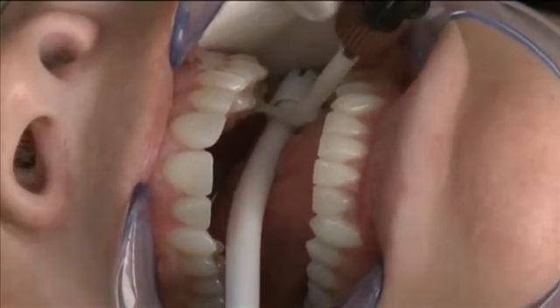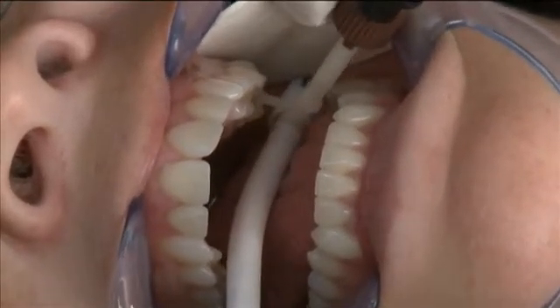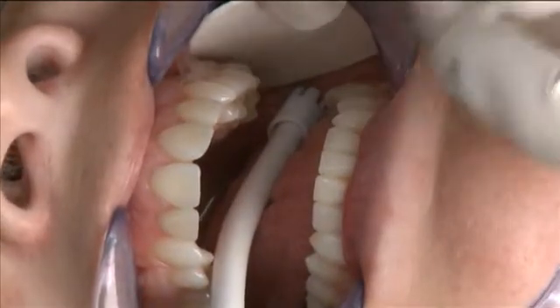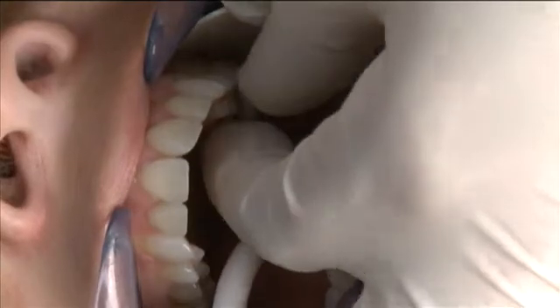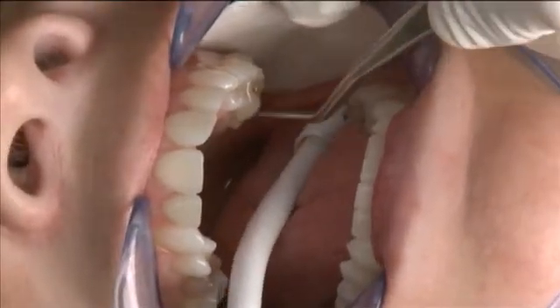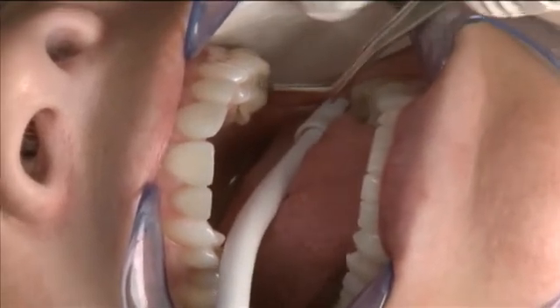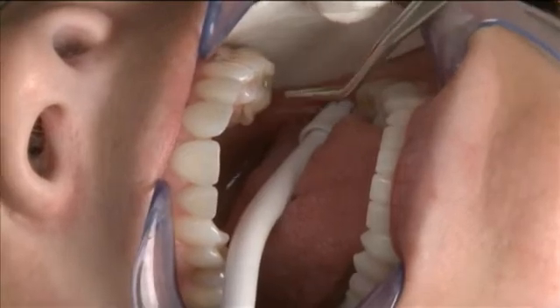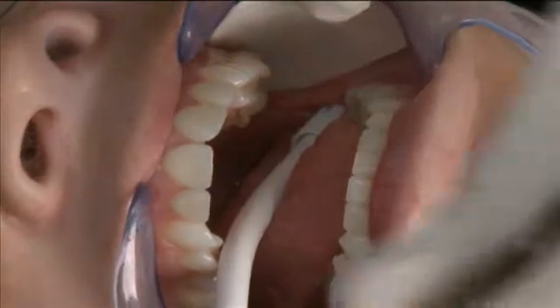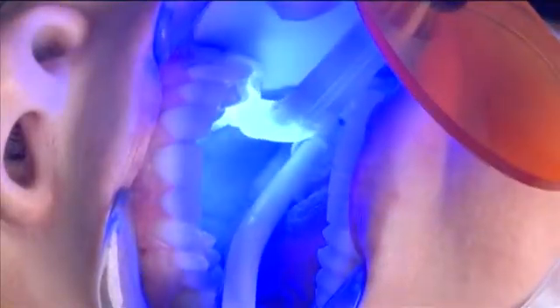Once that's complete, we'll insert the restoration into the preparation and allow the excess resin to flow out the adjacent areas, as you see here. We seat the restoration, pressing into place with an instrument. Once we know that it's completely seated, we can come back and do a little tack cure with the curing light, and of course do a little cleanup before the final cure.